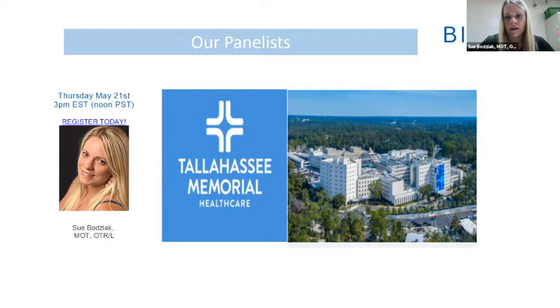And at our clinic, we are attached to an inpatient clinic as well. So sometimes for our robotic arm, we'll have people come from the inpatient to use the robotic arm as well in our clinic, which is really nice. We have occupational therapy, physical therapy, speech therapy, and a social worker on staff for counseling. I work with two other occupational therapists and a COTA.